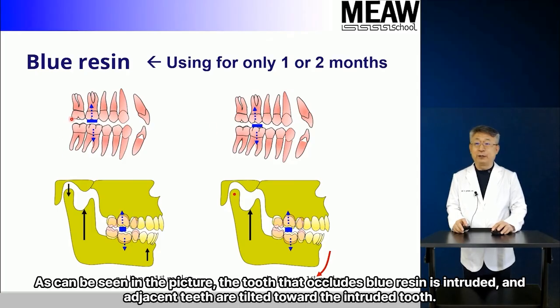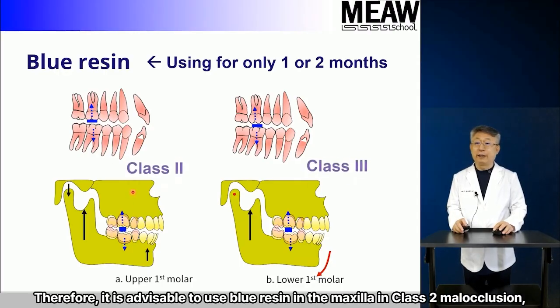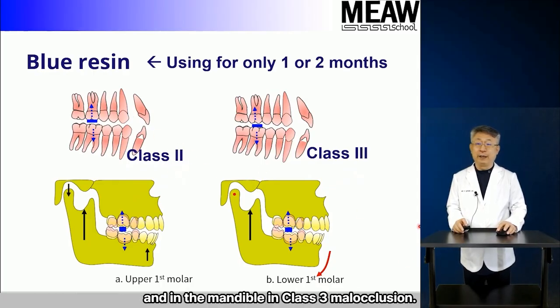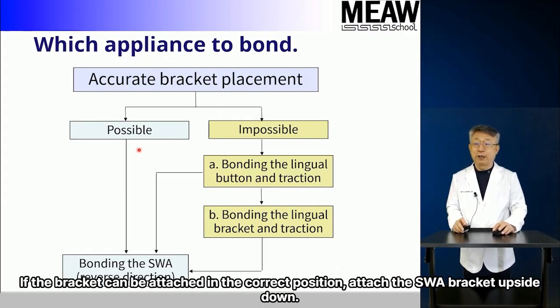As can be seen in the picture, the tooth that occludes blue resin is intruded, and adjacent teeth are tilted toward the intruded tooth. Therefore, it is advisable to use blue resin in the maxilla in Class 2 malocclusion, and in the mandible in Class 3 malocclusion. If the bracket can be attached in the correct position, attach the SWA bracket upside down.